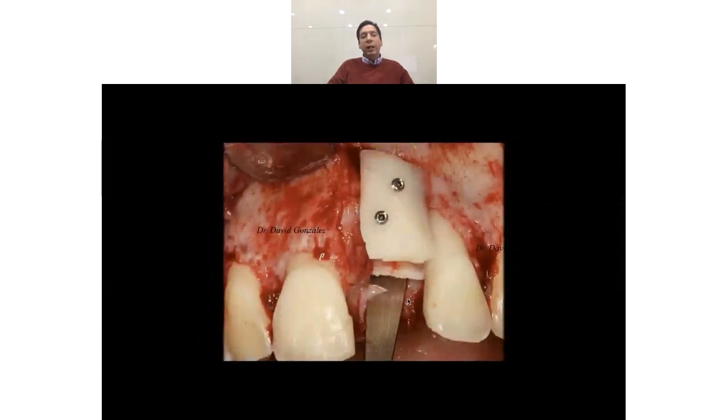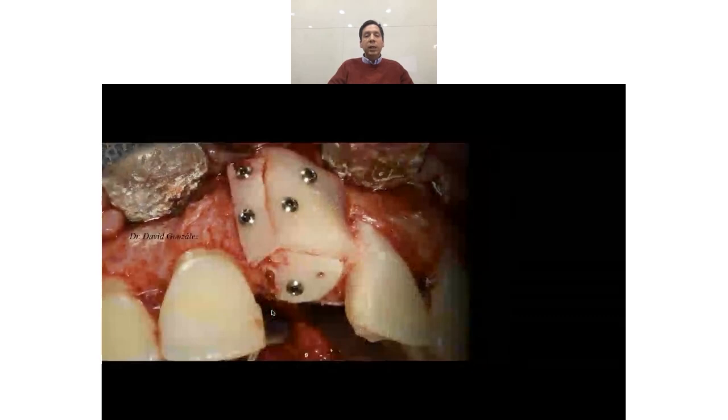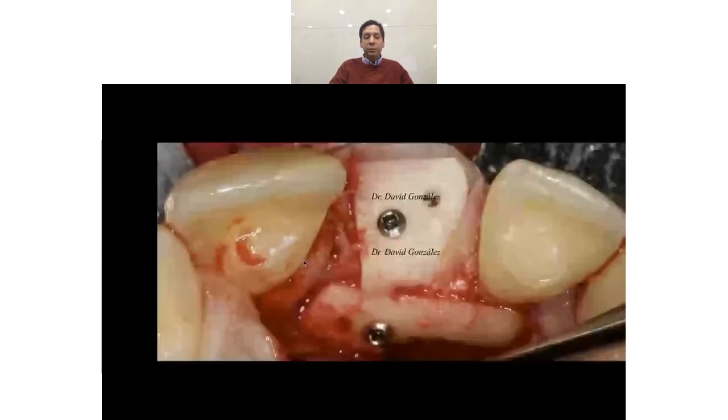And then I cut the block, I split the block, and I put one big block on the buccal side, another big block in the palatal side. You can see the ceiling of the palatal aspect in here. And then I put another block, a small block in here, and another in the coronal aspect. So these are the final blocks I placed. This is the buccal block, the palatal block, and the coronal block. The coronal block is very, very strong, but I didn't want to touch the root of the lateral incisor.